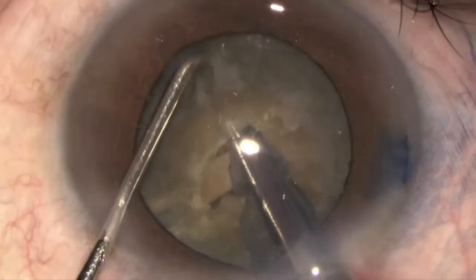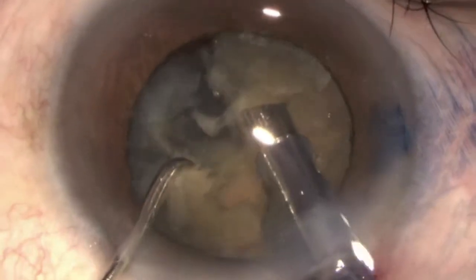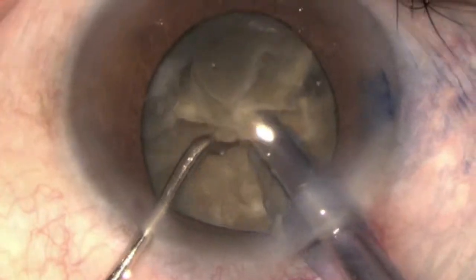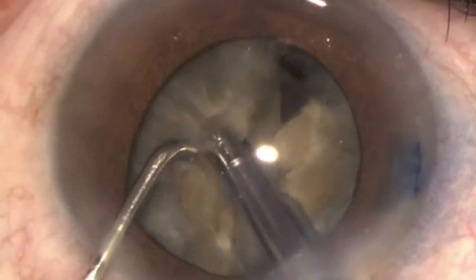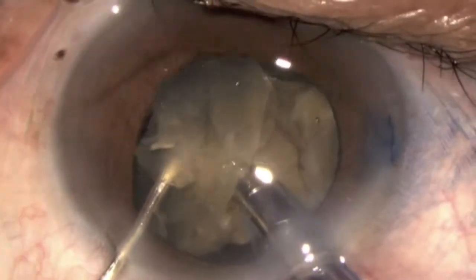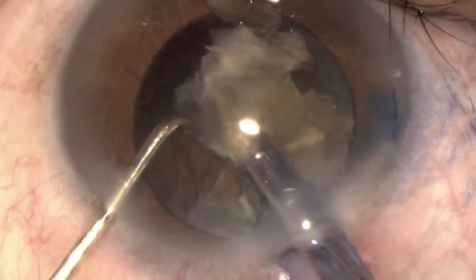Once complete nuclear division is achieved, the nucleus is rotated 90 degrees and the same procedure is repeated to further chop the nucleus into multiple fragments. The free lens fragments are then very simply and quickly emulsified and consumed.